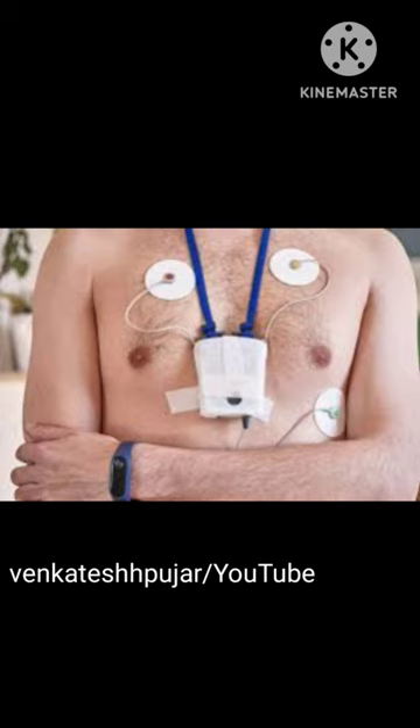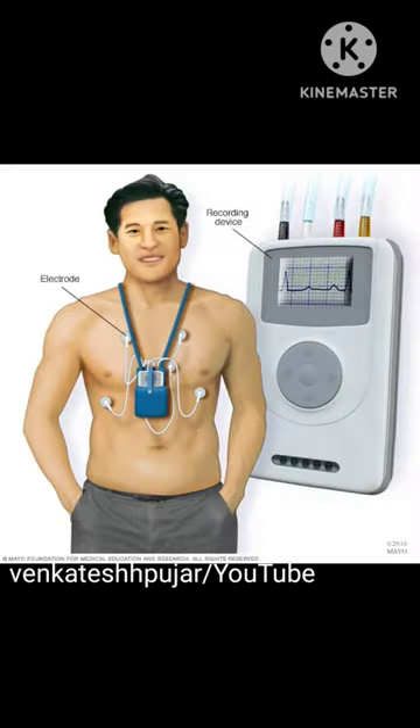A Holter monitor test may be done if a traditional electrocardiogram, that is ECG, doesn't provide enough details about the heart condition.